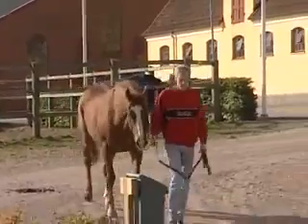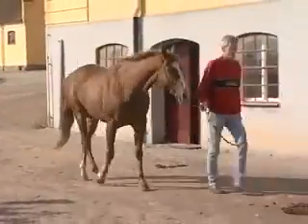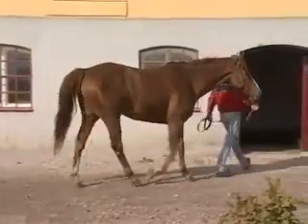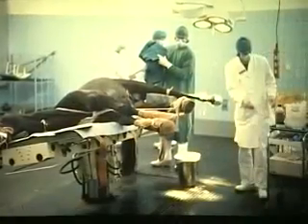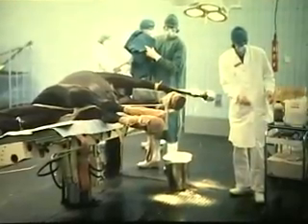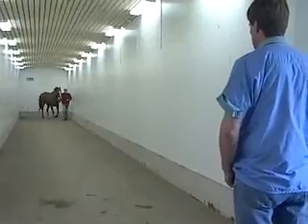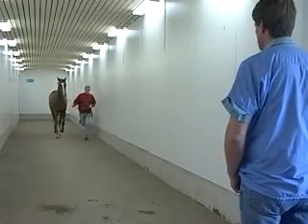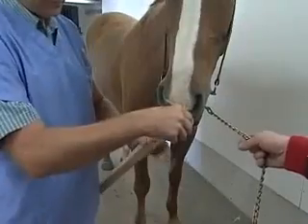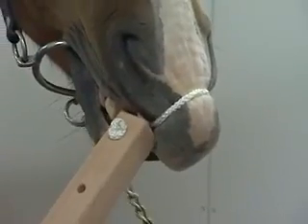It is possible to access all major joints in both the fore and the hind legs with the horse awake and in the standing position. Some joints are very easy to puncture, for example the carpal joints, while others require more training. When infected joints are flushed or when joint wounds are treated, tranquilizers or general anesthesia can be used as needed. When working with lameness evaluation, however, it is not advisable to tranquilize the patient because sedation may affect movement patterns. If needed, a nose twitch is used to keep the horse still during arthrocentesis.